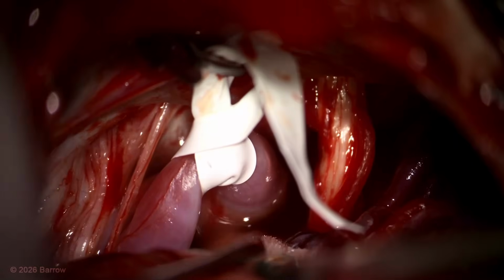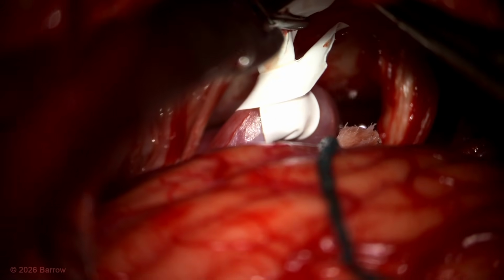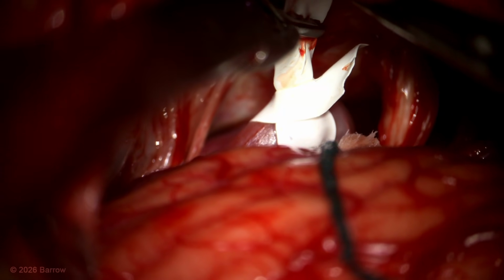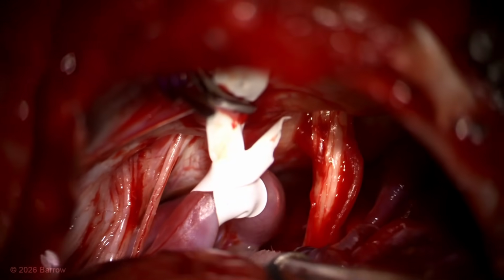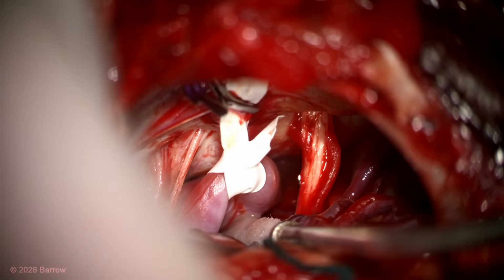With inspection, I'm concerned with the stenosis of that V4 segment. Therefore, I'm going to release the clip and slacken the tension just ever so slightly, and this looks better. Now you can see how that loop of V4 is pulled out of the brainstem and forward, and ICG video angiography confirms patency of flow within that artery.